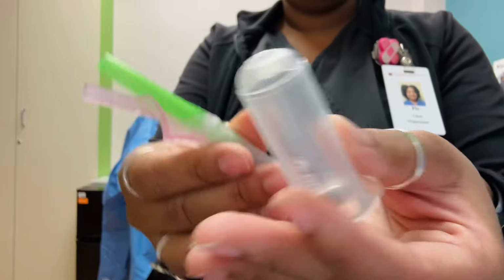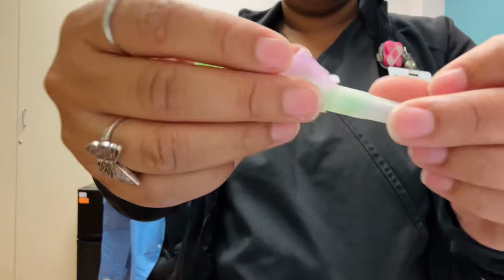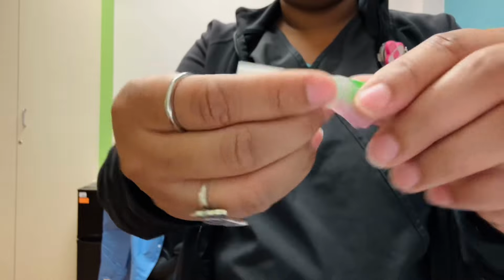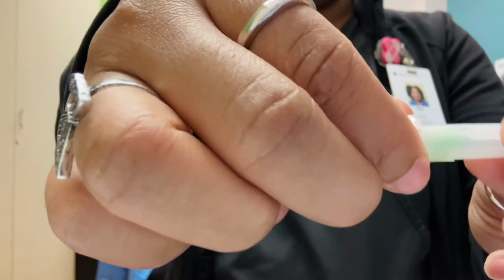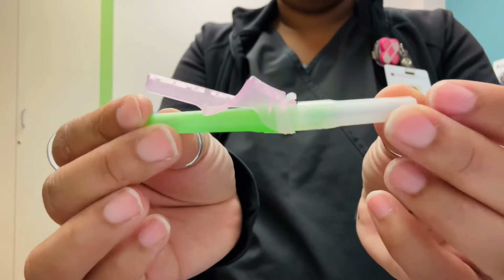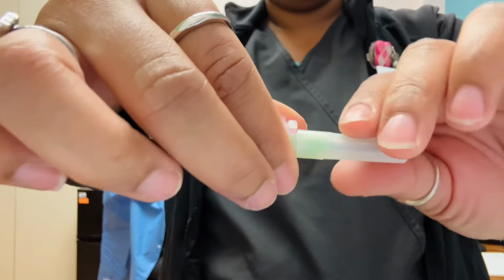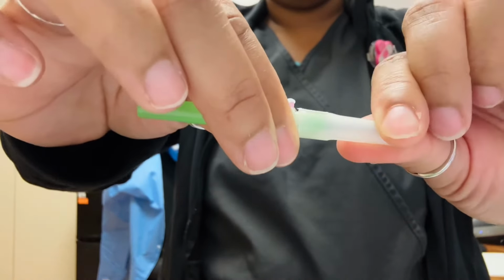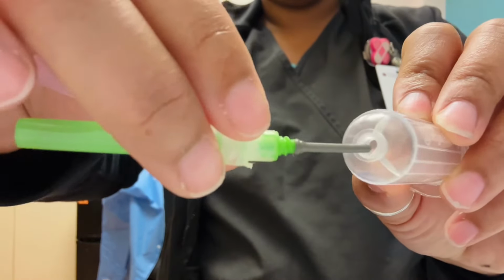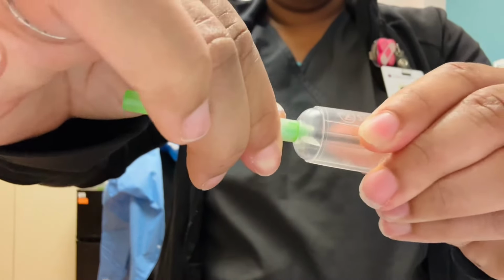Now I'm going to show you how to use the needle with the safety on the needle and a hubcap that doesn't have a safety on it. So it's pretty much going to be similar. The same color top means that's where the needle is, and the other side is where your other needle is with the rubber sleeve. So you're just going to remove it as if you did the other needle. One big difference when using the needle with the safety lever on is that when you remove the cap on the needle side, your bevel is already going to be facing the right direction, which is up, and your lever is going to be lifted up towards you. That's perfect because you are ready to go as soon as you put it inside of the hubcap.